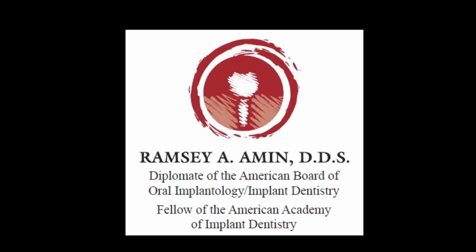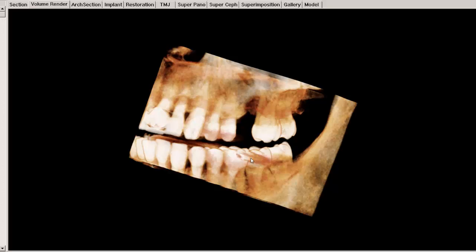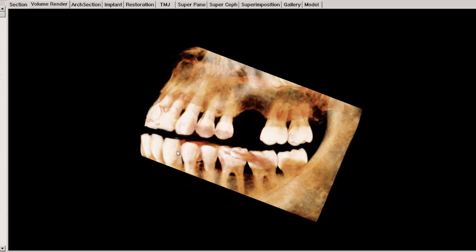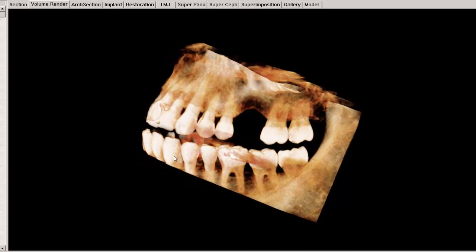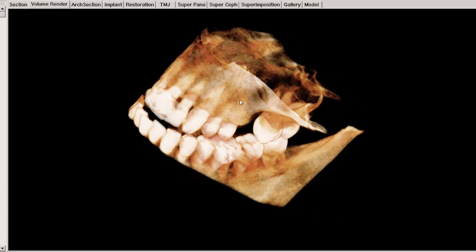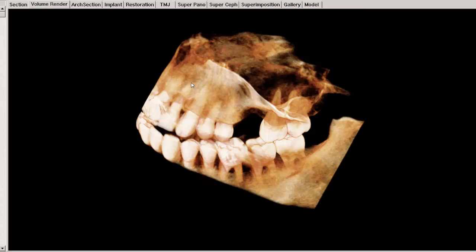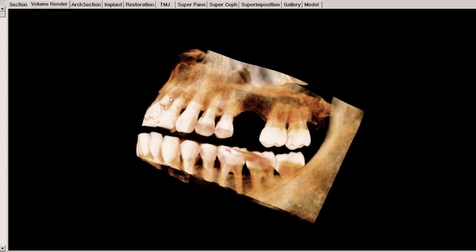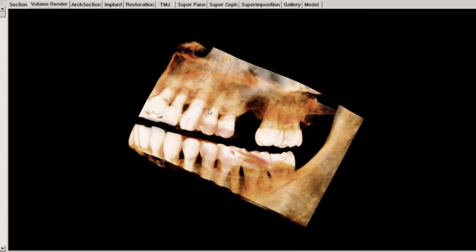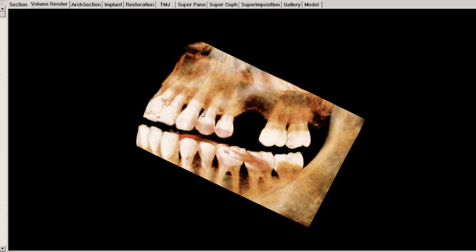Welcome. Today I want to introduce you to some three-dimensional planning. This is a patient that is obviously missing a tooth. You are looking at a cone beam three-dimensional image of this patient's left side. They are missing tooth number 14, which is this molar tooth we call the first molar — a very important tooth.